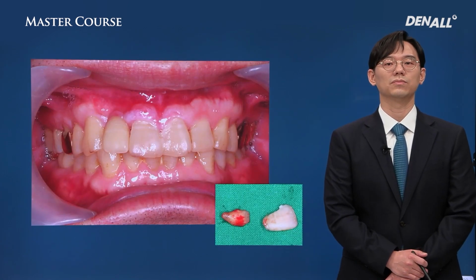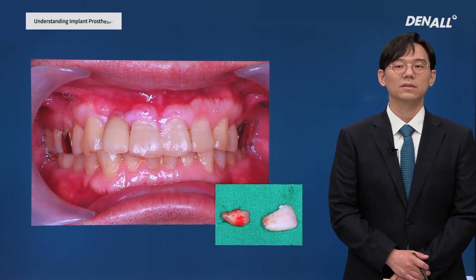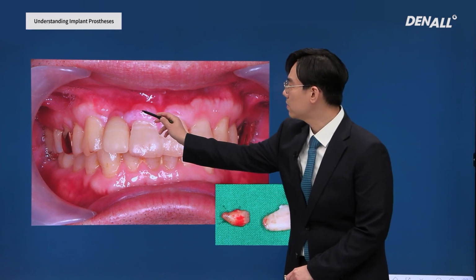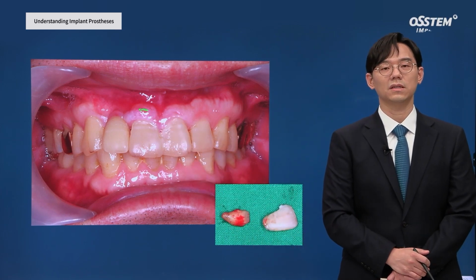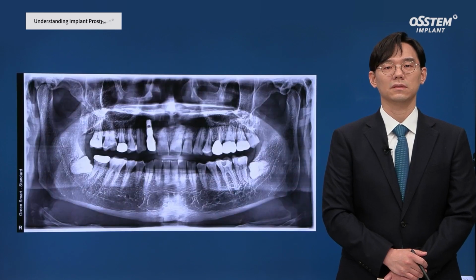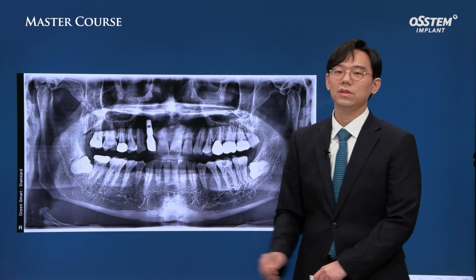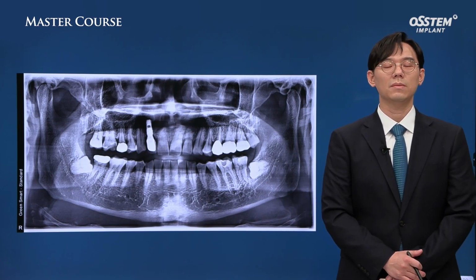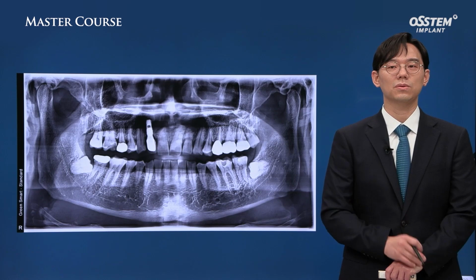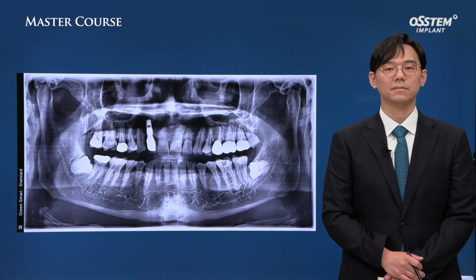The person had a fractured anterior tooth. Number 11 was mobile. Looking at the pattern, I felt a fulcrum over here, and a fracture in the middle of the root was confirmed. In number 12, there was already an implant prosthesis, so bridge treatment was not recommended here.